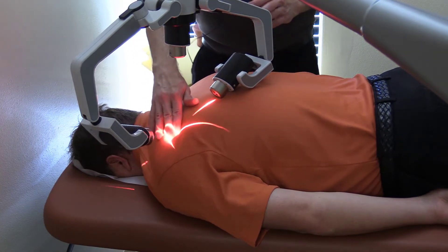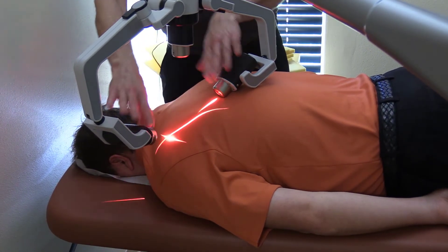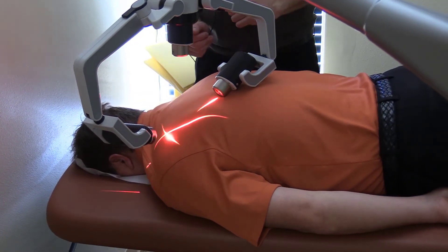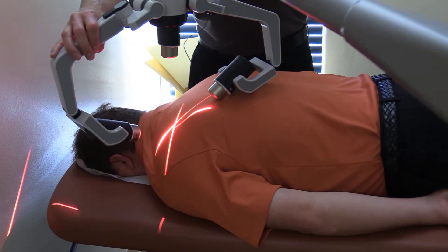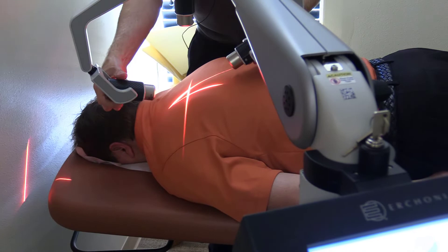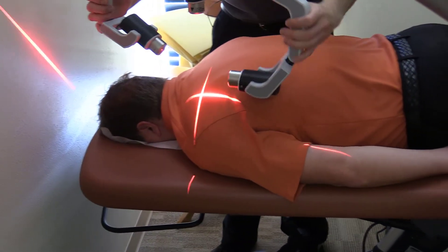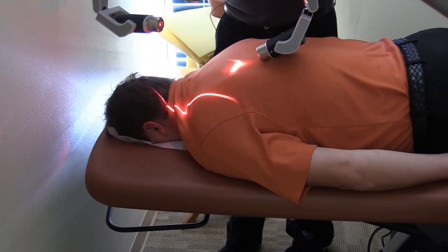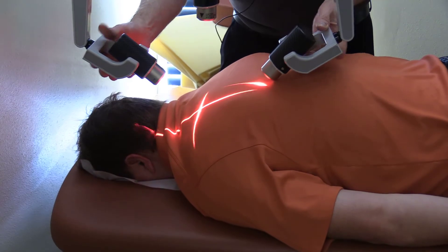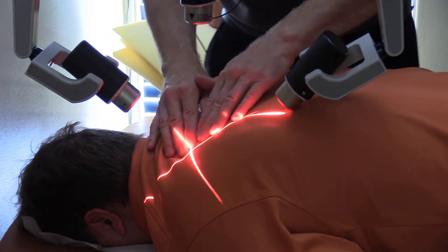Just whatever knots or tight areas you want to work on, orient the two outer lasers so you can get them in the best spots to treat that, and let the middle one do its best. From this position you can also get the upper back. You can get this right like this — it's a great way to get the erector muscles that go straight up and down, the spinal erector muscles.